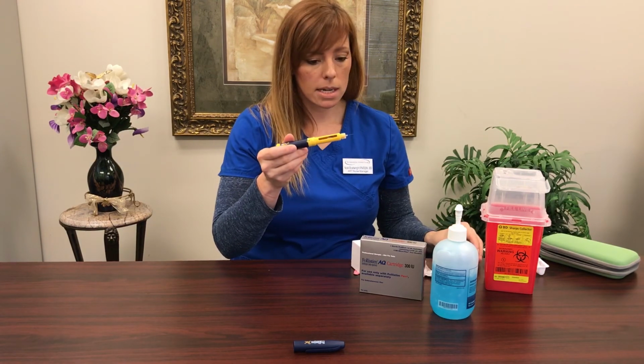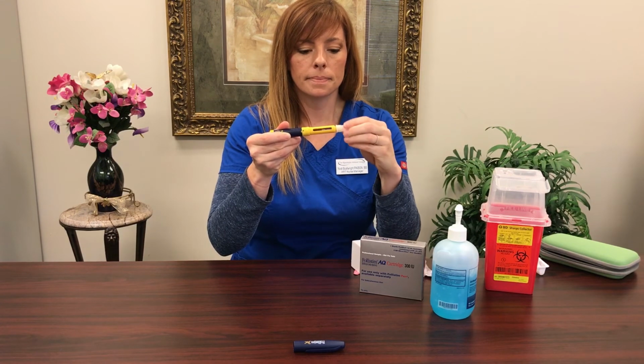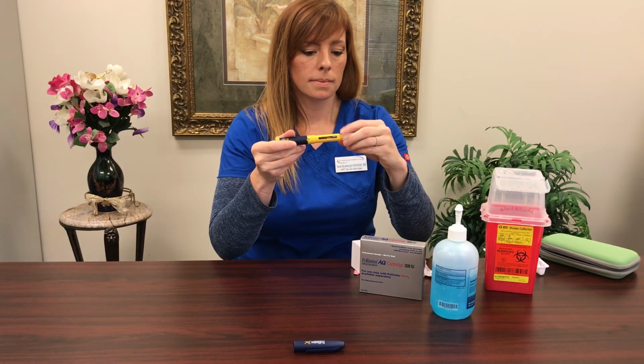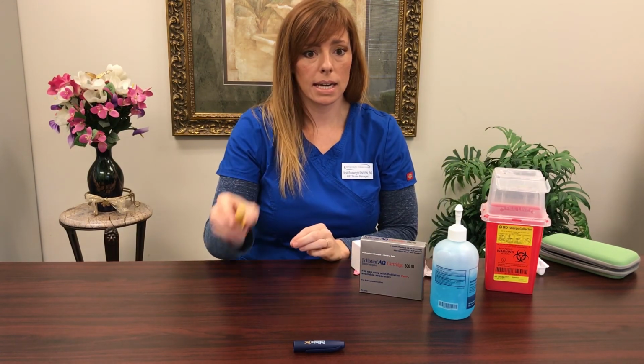For today, what I want you to do to dispose of this needle is take this cap, put it back on, unscrew your needle, be very careful, put it back in your sharps bin, and you're ready to go for tomorrow.